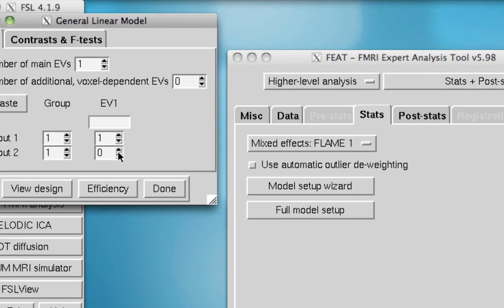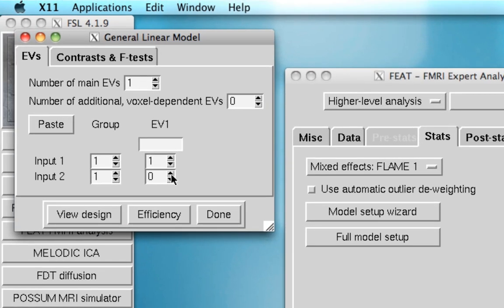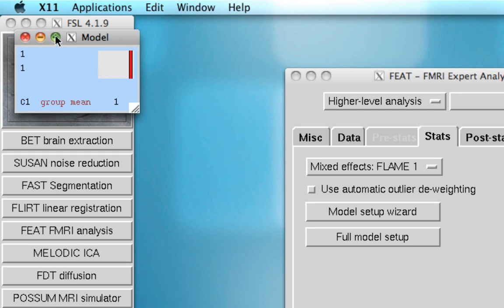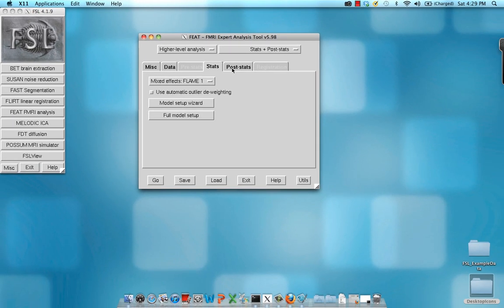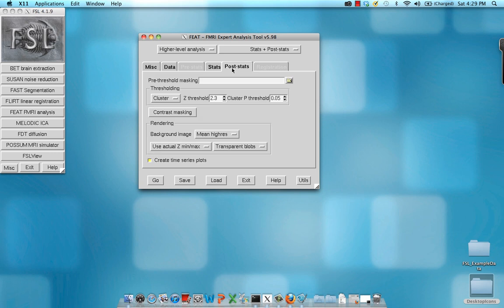In the full model setup, here I'm going to assign equal weight, an equal weight of 1, for each feed directory. That means that for all the contrasts that I'm conducting, I'm going to assign equal weight to both of these runs. Okay, hit done, and that's the representation of what it's going to do.